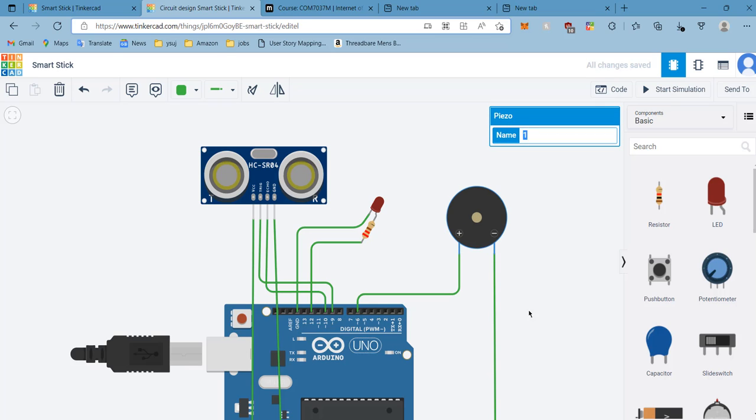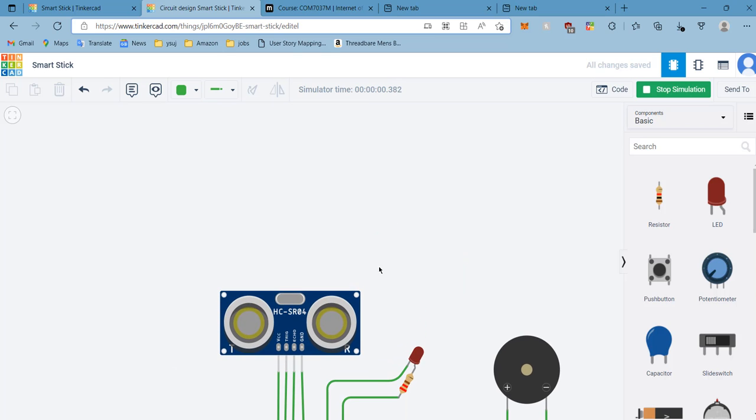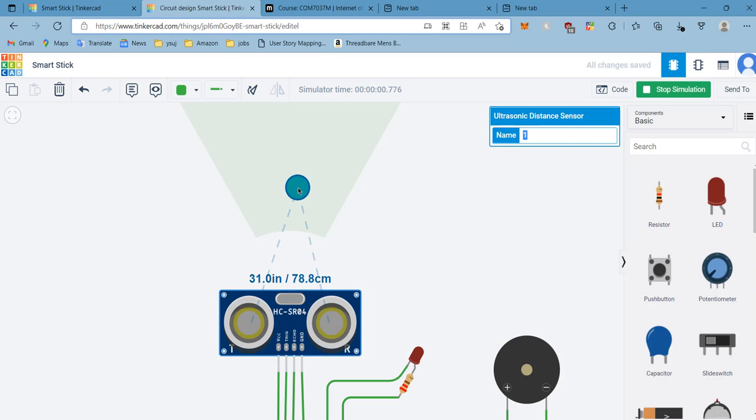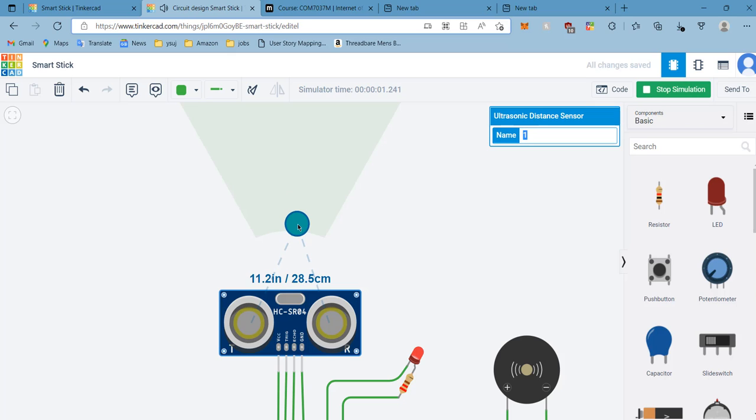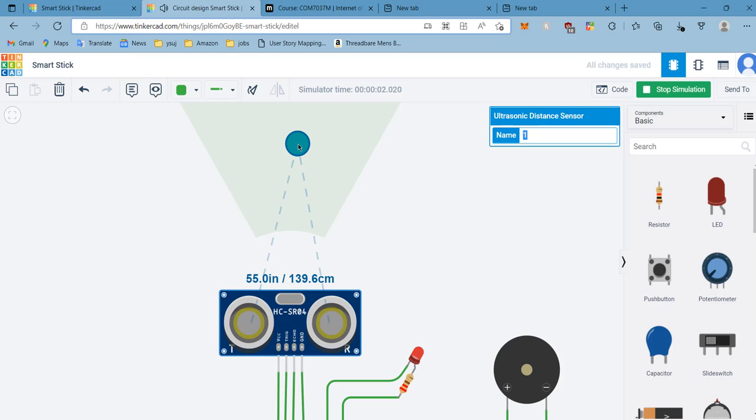For the piezo buzzer, the anode part is connected to pin number six and the cathode is grounded. When the object is near to 50 centimeters, it starts buzzing. You can see the LED light blinking and lighting up as well.